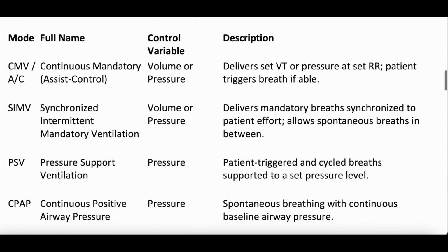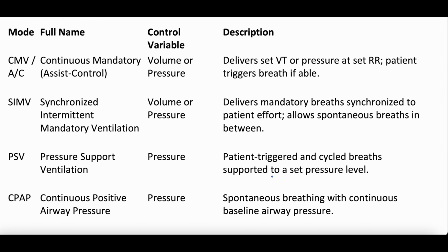All right, what about common ventilator modes? So here we'll break it up into kind of mode, name, controlled variable, and description.